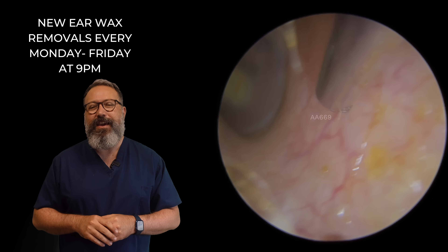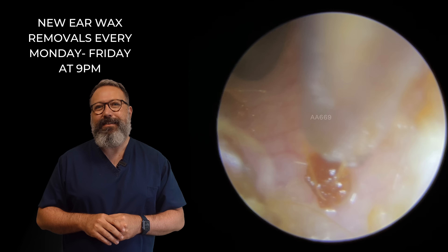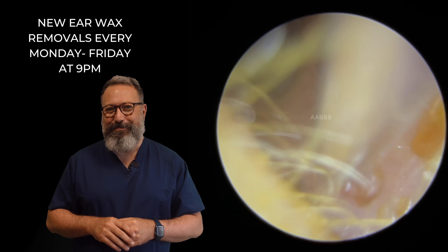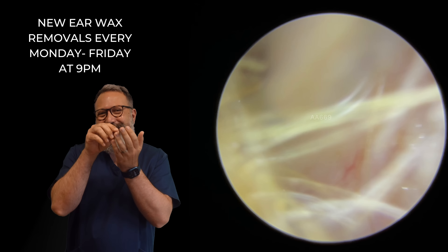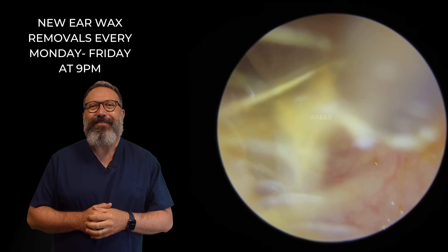And there, there you go. And let's get rid of that bit as well. Nearly, nearly. I'm just trying to... The patient was actually talking to me at this point. So I was aiming for this one tiny little piece of wax — the patient was talking to me and I was doing this. So it was really difficult to try and land straight on top of it. There we go.